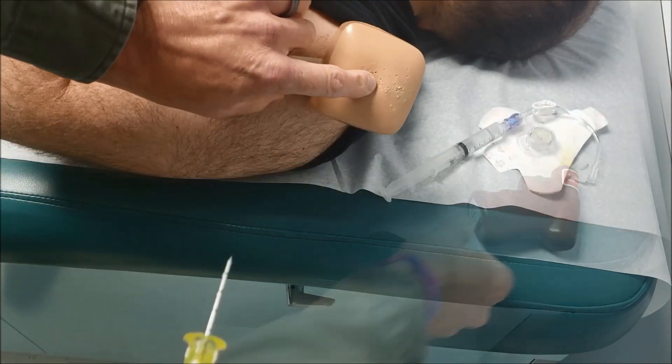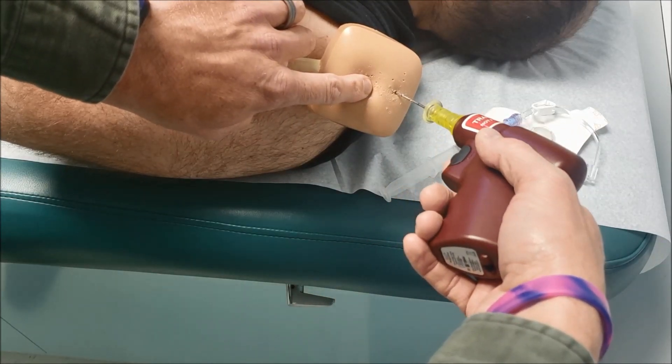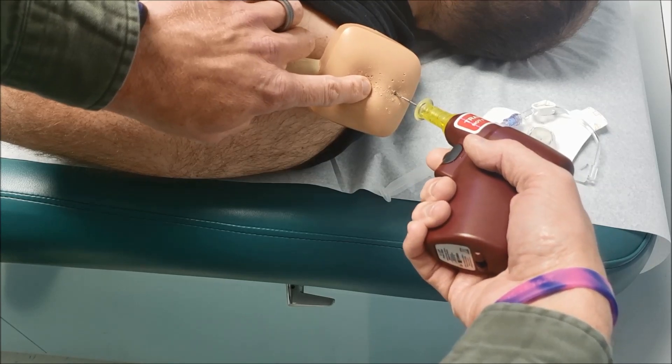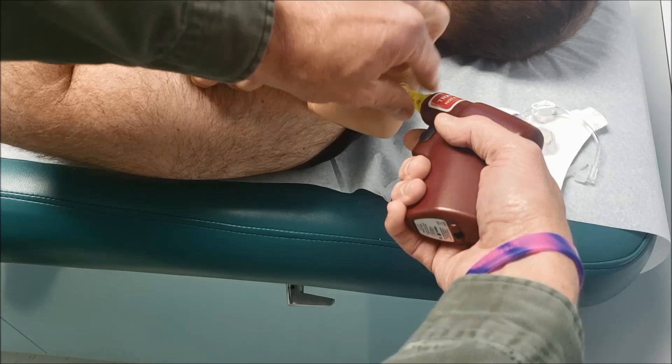I've located my landmark for insertion in the proximal humerus location. I'm at a 45 degree angle to the patient's opposite hip. Insert the needle until I hit bone, drill the needle into place, unlock.